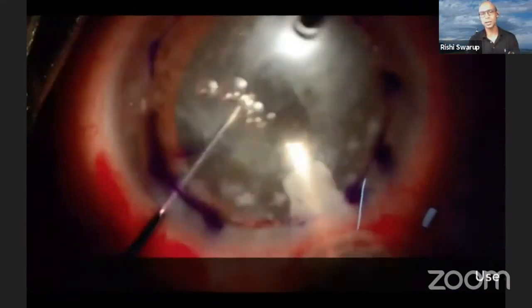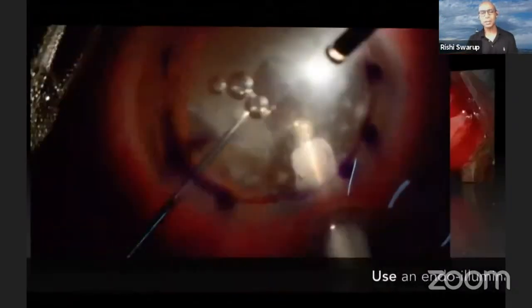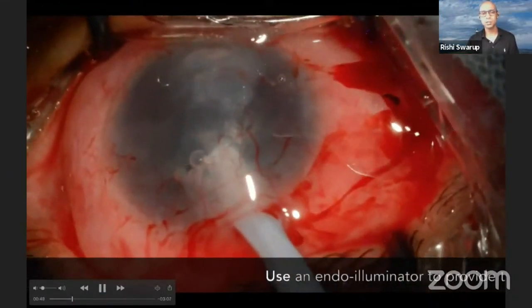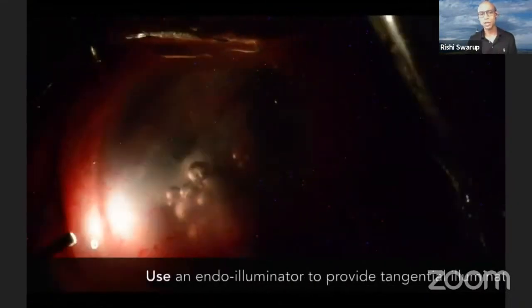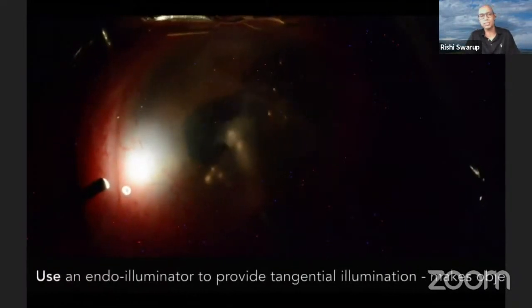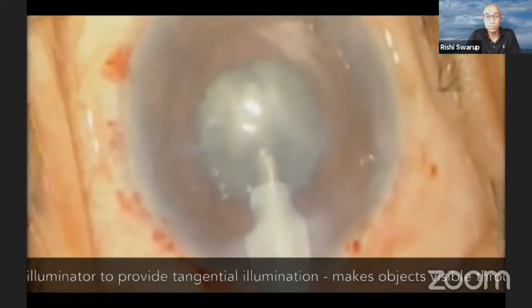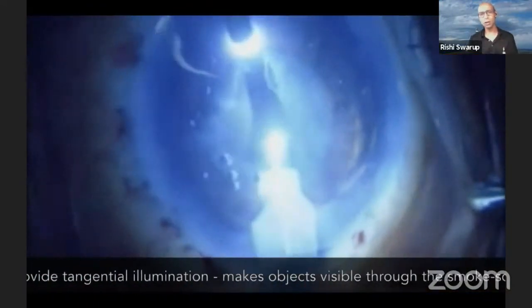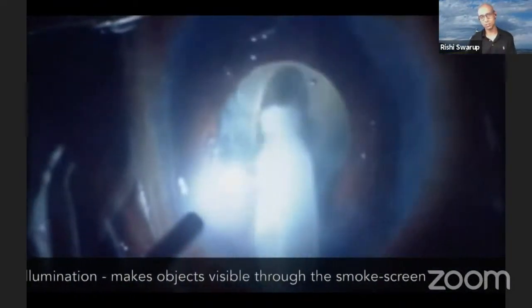I think this is probably the biggest tip that I'd like to give. Keep an endo illuminator in your cataract OT very, very handy, irrespective of whether you're anterior segment or posterior segment. It makes visualization of every step of cataract surgery much easier. You can see this patient with Stevens-Johnson with such a bad cornea. You can't see a thing in coaxial illumination, but the moment you start putting an endo illuminator, everything inside the eye is visible. It can help you on every step from rhexis to nucleus management to cortex aspiration to vitrectomy if you need to do one, or if you have a Descemet's detachment, it can help you visualize the Descemet's. So all structures in the anterior segment can be seen very well through any sort of an opacity if you use this kind of a light.